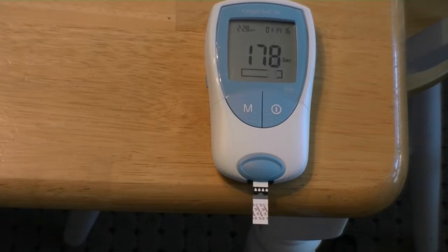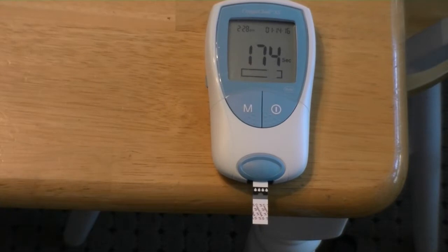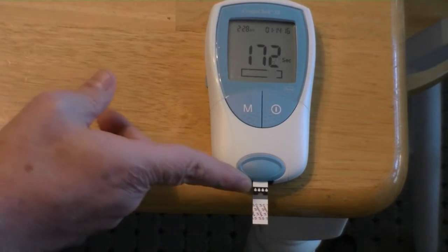It tells me I have 179 seconds and you can see the countdown on the display. There's a little blood droplet icon telling me that I need to apply blood to the strip.